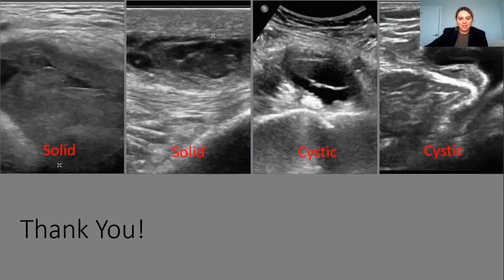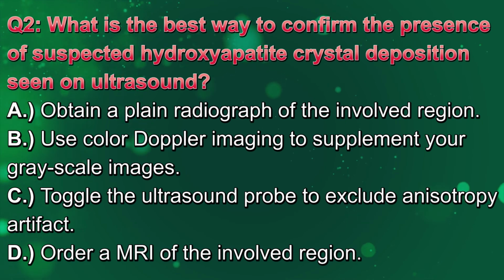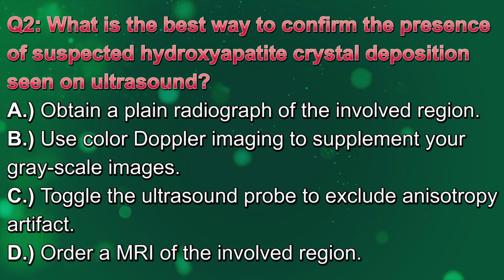Next question. This is a good one that we didn't necessarily discuss, but certainly a very helpful troubleshooting tool if you're worried about the presence of hydroxyapatite crystals in your cuff or in your bursa.